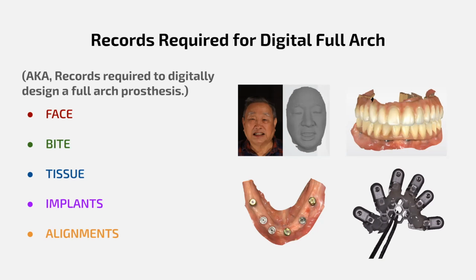Of course, very importantly is the implant positions, and that's why we're all here with OPTISPLINT, making sure that our implant record is as perfect as possible. Having an implant record that we can use to verify before we go back in the patient's mouth is critically important to make sure that the manufacturing and everything else that happens after we take our records is actually as accurate as the record itself.